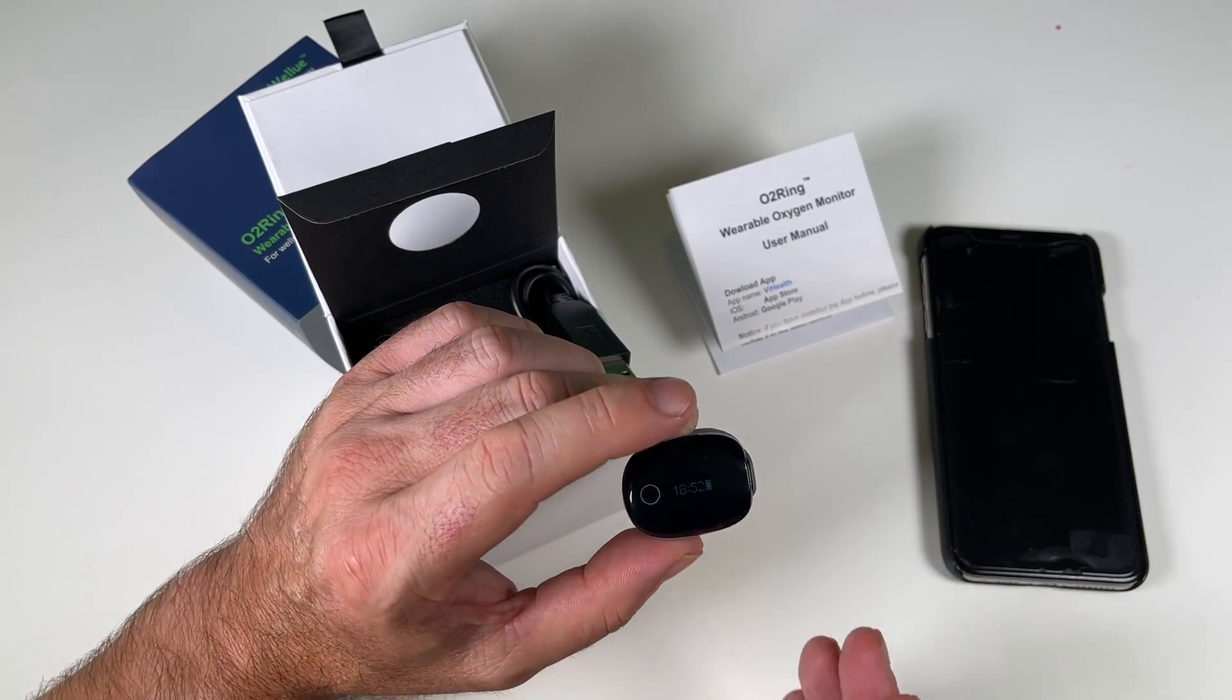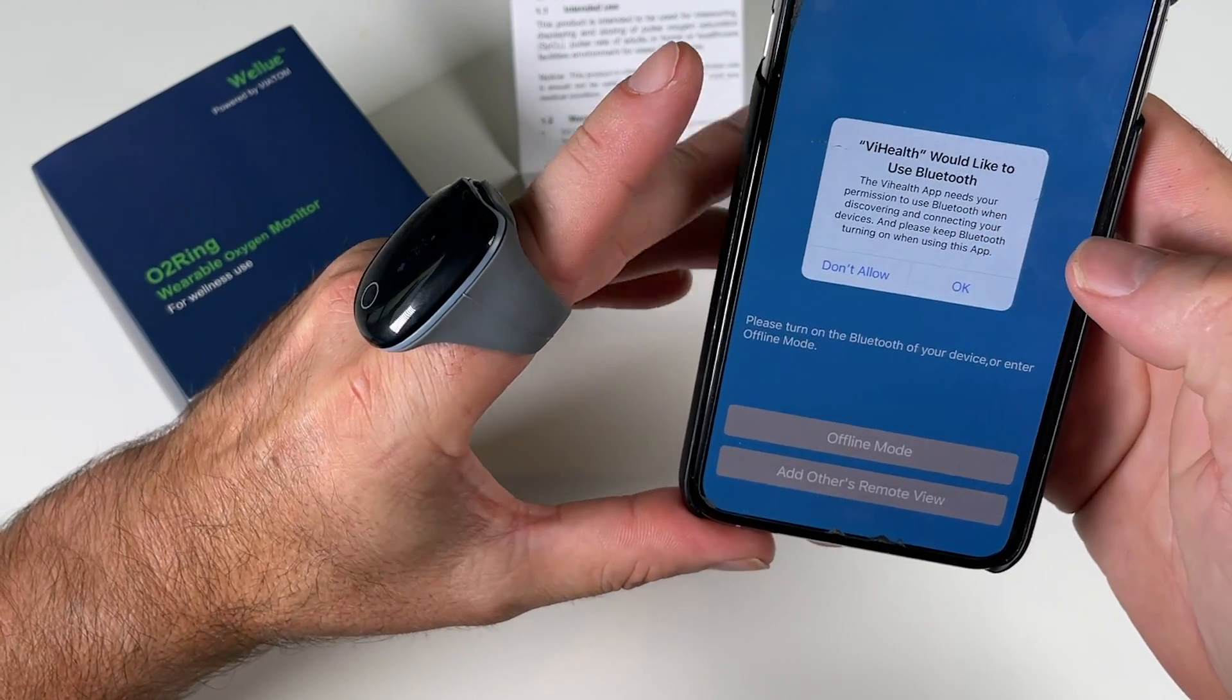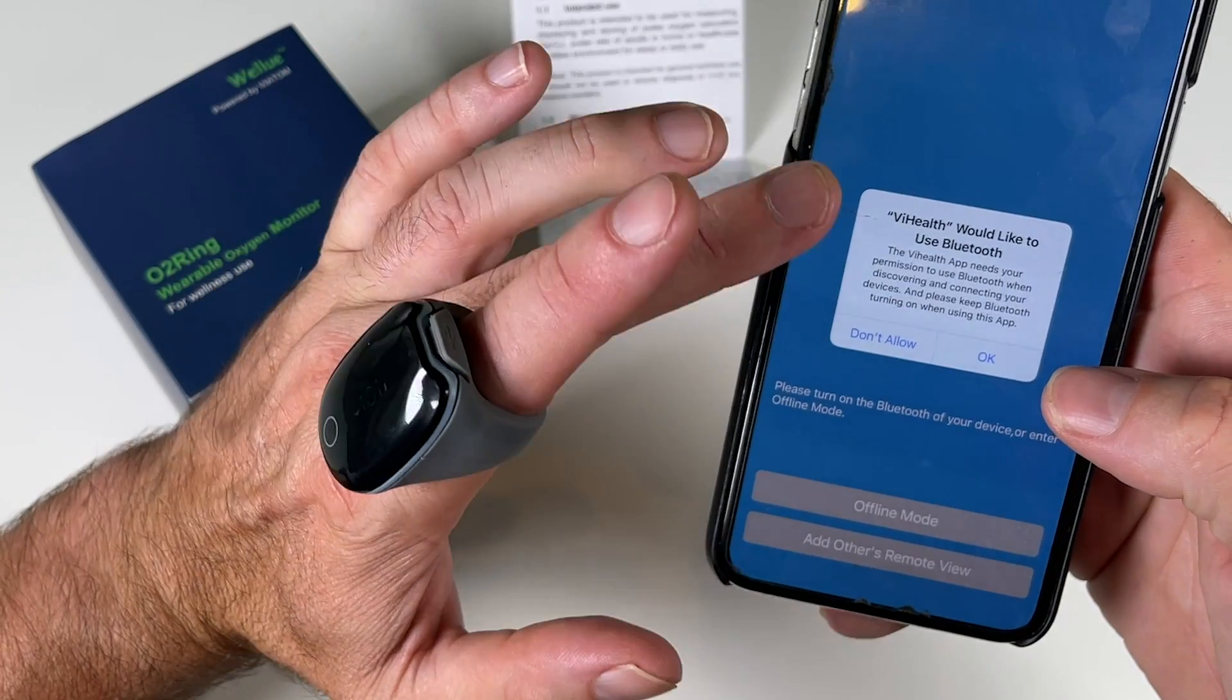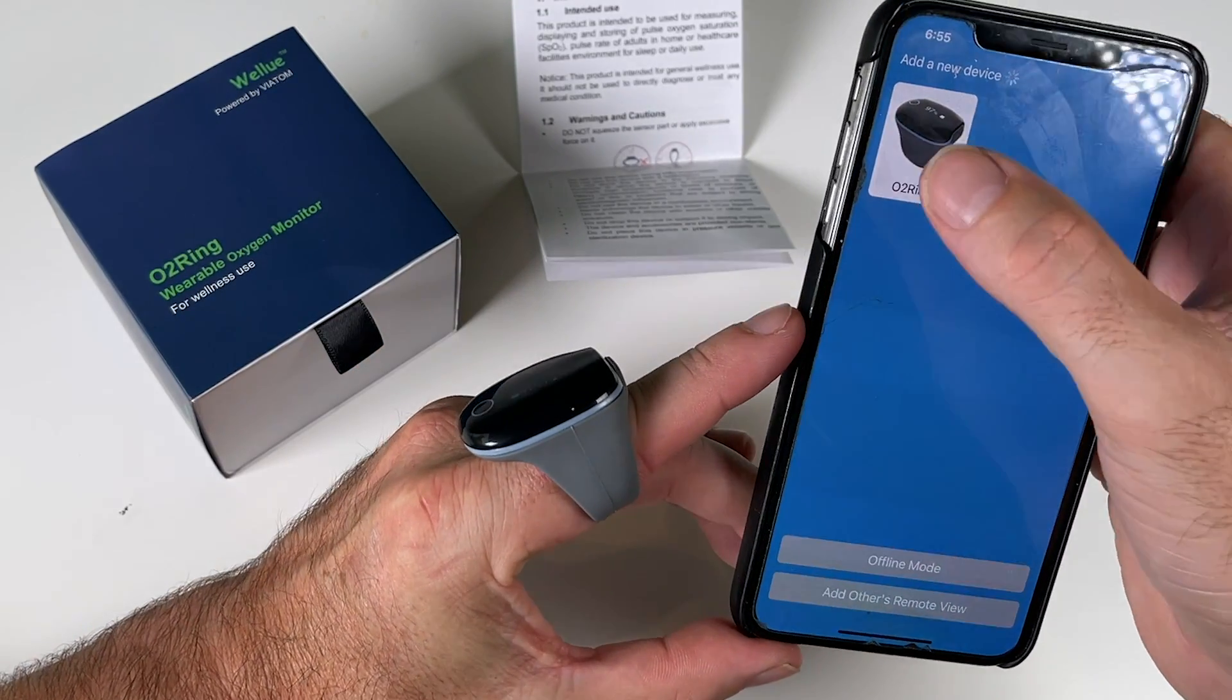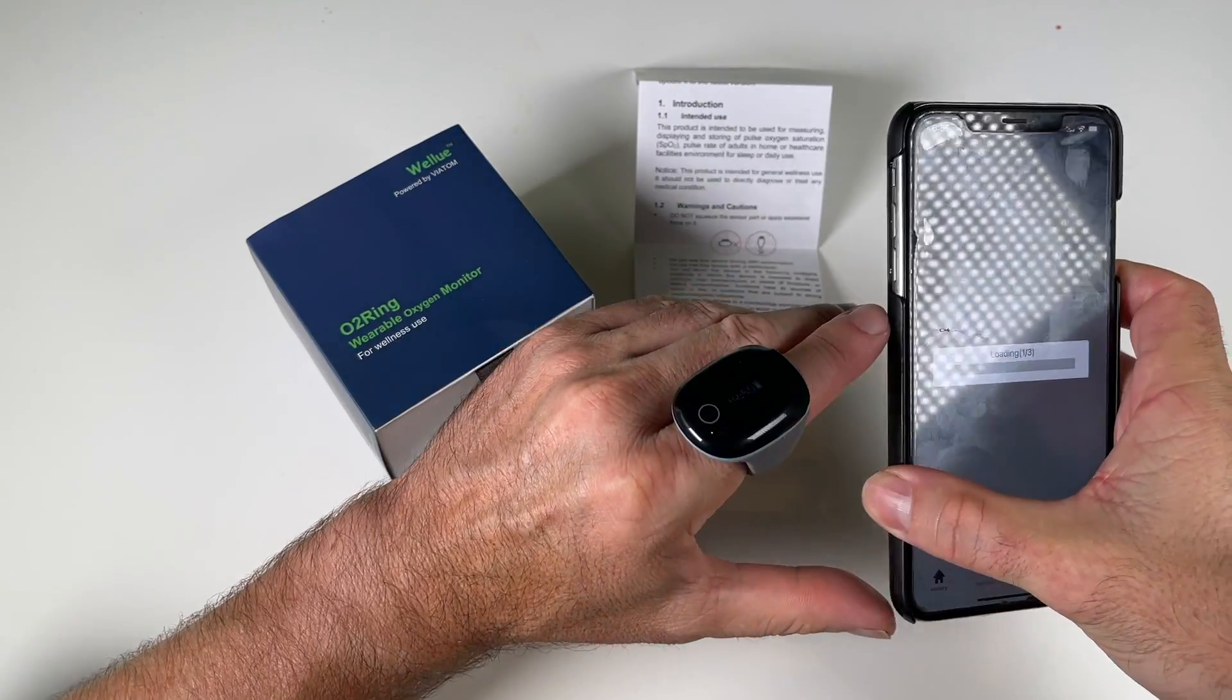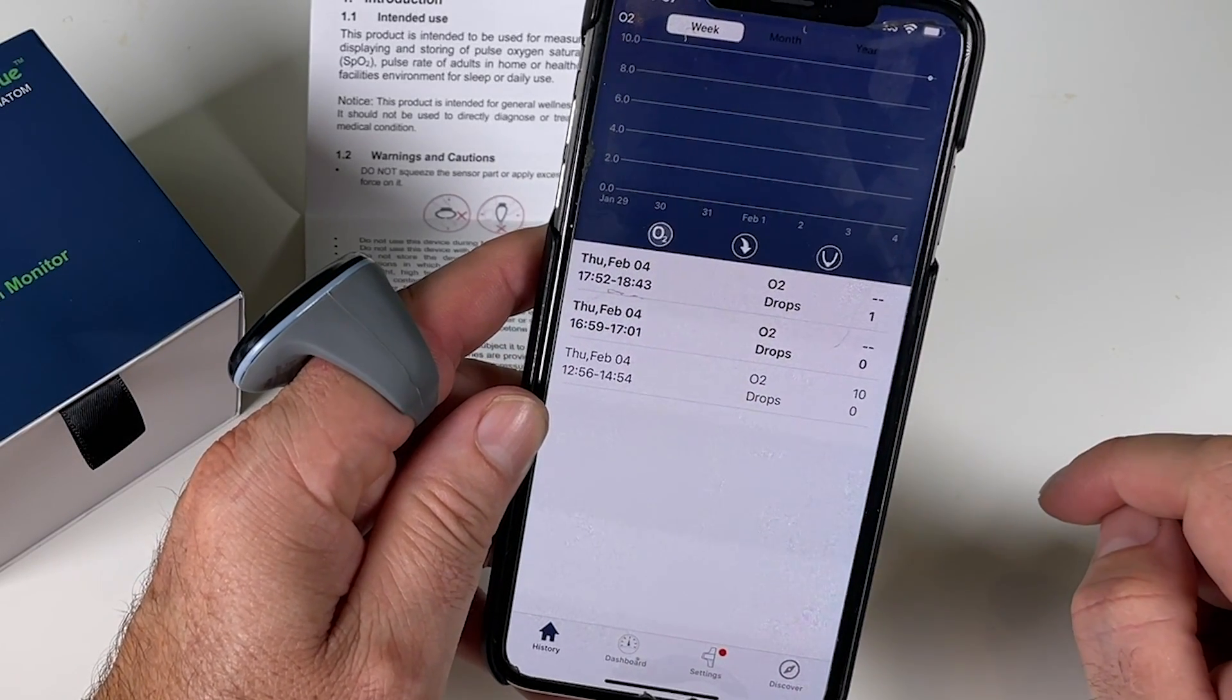When you're ready to use it, the first thing you want to do is download the app Vi Health. Right, here it is here, Vi Health. And it says here, Vi Health would like to use Bluetooth. So make sure you've got Bluetooth on your phone on, but don't connect through your phone's Bluetooth through the settings of the phone. You want to connect through the actual app itself. So just click OK. It's going to search for the ring. Just have it close by. There you go. It's come up with the O2 ring. Click on the O2 ring. And then you just tap on the top of the device where it says tap there.